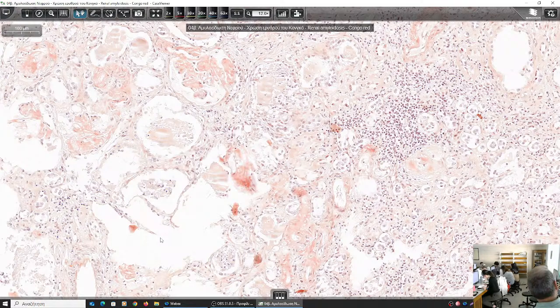I know that for this case it's clear, but in another case, could the atrophy of the tubules also be caused by a renal stone? If you have a renal stone someplace where the urine cannot leave, you have dilation. It's going to be of a different nature. You have dilation, however, the end result is the same. They will become microcystically dilated and atrophic. This is the case of chronic pyelonephritis that we will discuss, hopefully, in the next semester. Okay? This is atrophy. That's all.